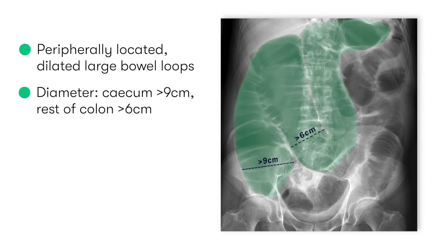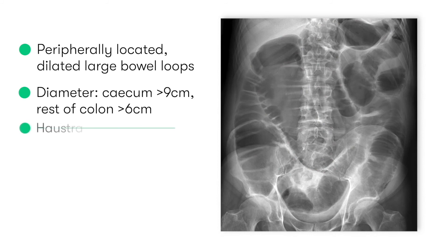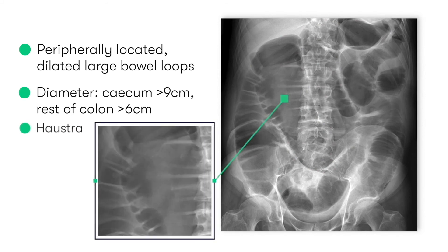We can tell that these dilated loops are large bowel rather than small bowel due to the presence of haustrae. Haustrae are saccular folds of mucosa within the large bowel which give it its characteristic segmented or pouch-like appearance, and you can see the haustrae highlighted here.